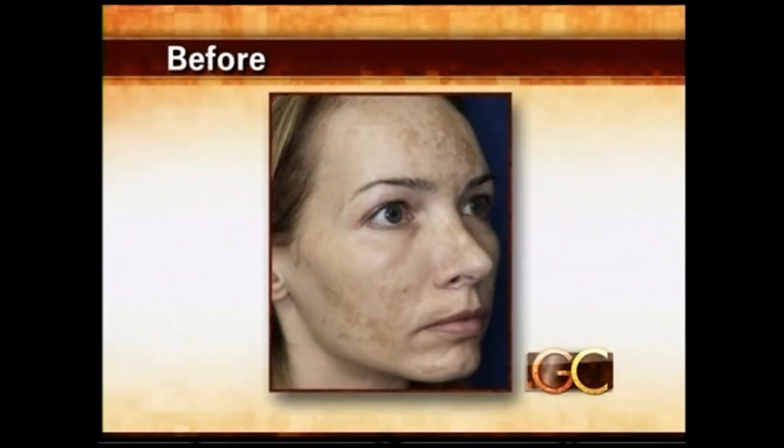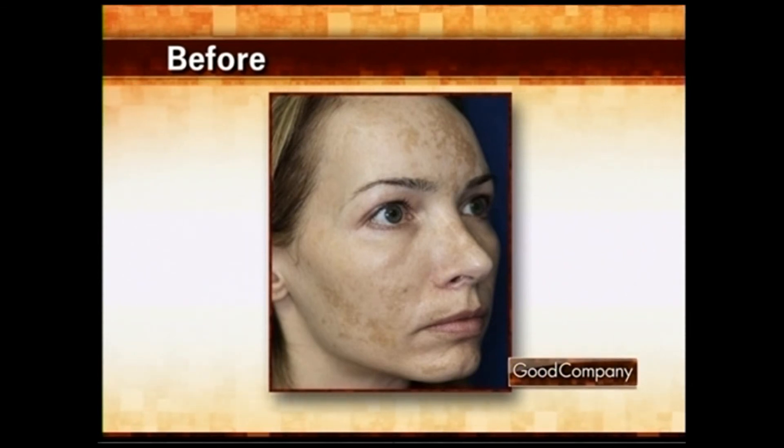Dr. Steven Goldman is now with us in studio, and Christine Olsenheimer is the patient we saw in the video. The laser treatment was two weeks ago today. Christine, why did you go to Dr. Goldman? Mostly the brown areas on my forehead and the cheeks across the nose.